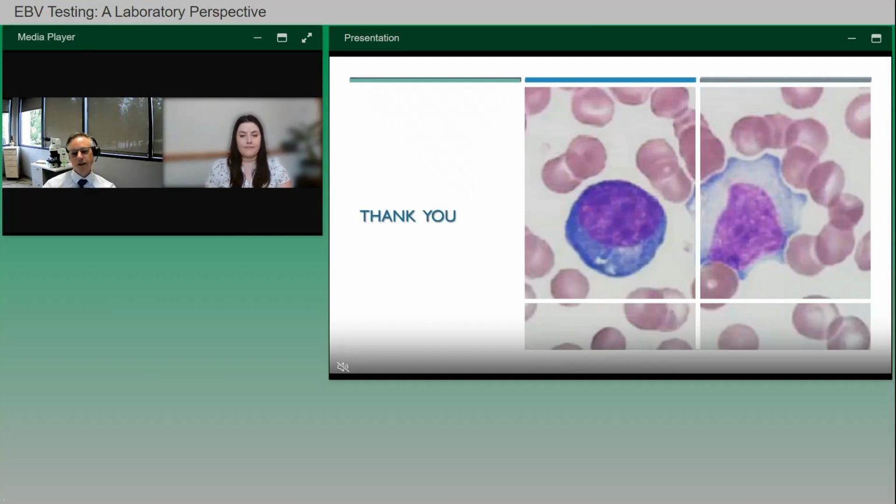Yeah, you don't need to add the heterophile IgM. They just recommend serologic markers. That's pretty much it. It's a pretty general recommendation. So no Monospot, but markers, and they don't specifically call out adding the other heterophile marker that we use in our panel. That marker, of the antibodies in that panel that I described, the heterophile antibody is kind of interesting, and it's a nice little acute phase confirmatory test, but it's definitely kind of the weakest of the panel. So CDC certainly doesn't require that.